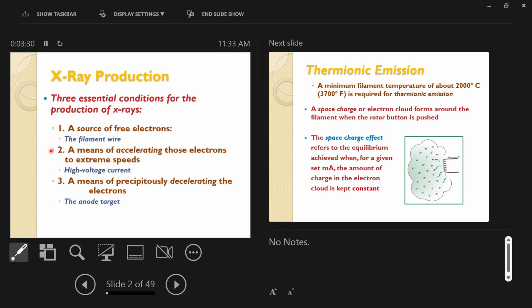We said earlier in today's stuff that energy is conserved, right, but can be converted into different forms. One form that energy can take is called kinetic energy. It's the energy of movement. An electron sitting still has a mass, a charge, and a spin, okay? But just consider its mass. It weighs something. You put it on a scale, it has some weight here on Earth. You put it up into outer space, and it has a mass but no weight. But importantly, there is some oomph to an electron. Even if it's a little bit of oomph, it's still there, okay?